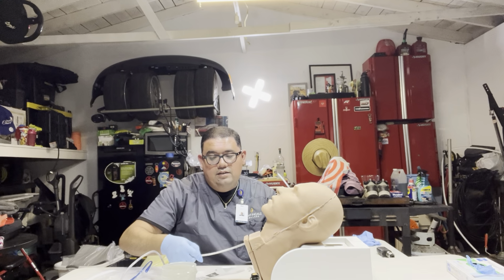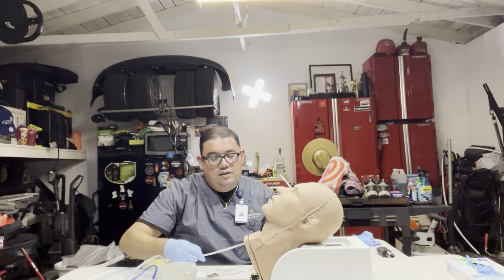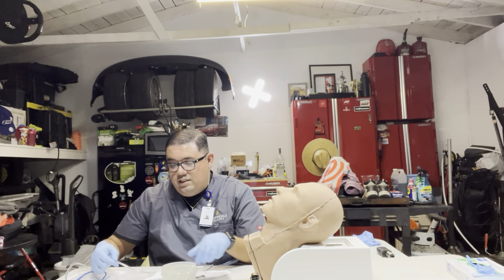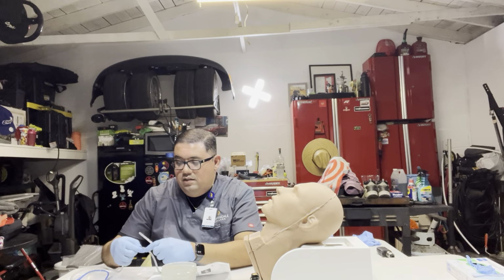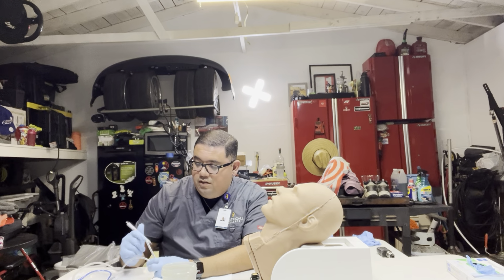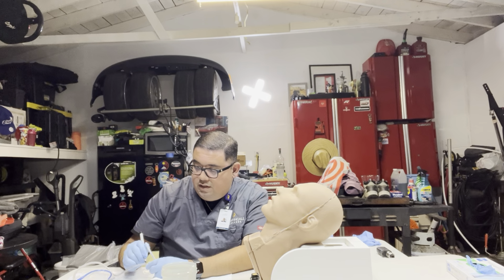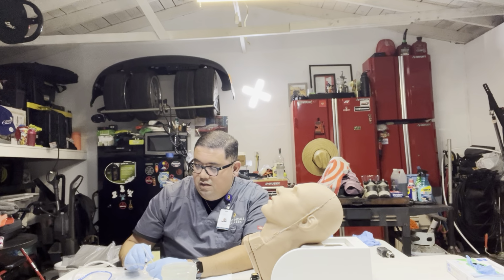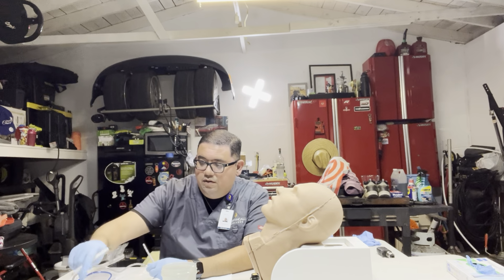Look at that. 60. Okay, we're gonna go ahead and take this off. I'm actually gonna mark it out real quick. Get my marker. Mark it at 60. Perfect.